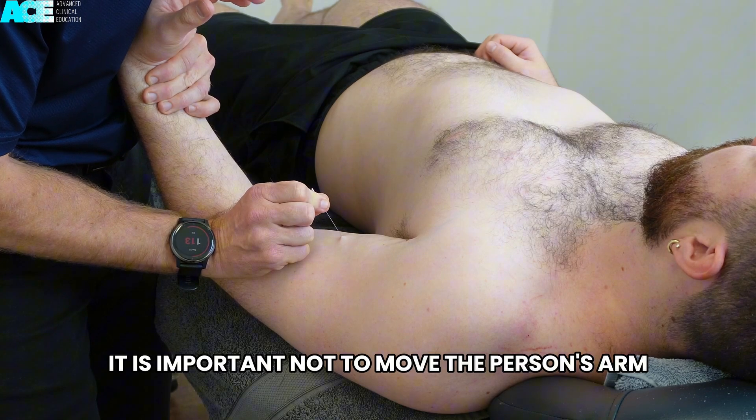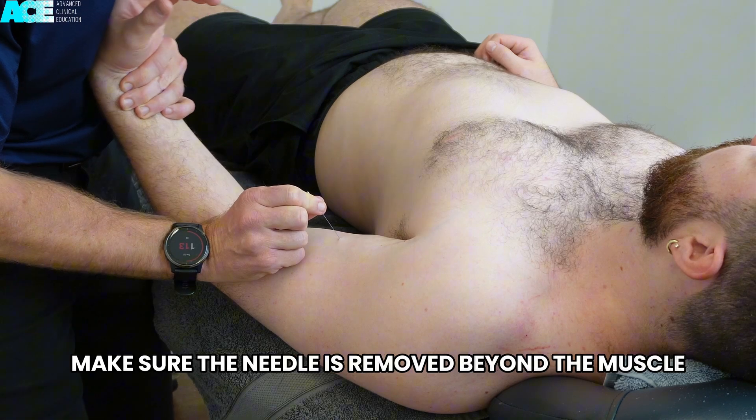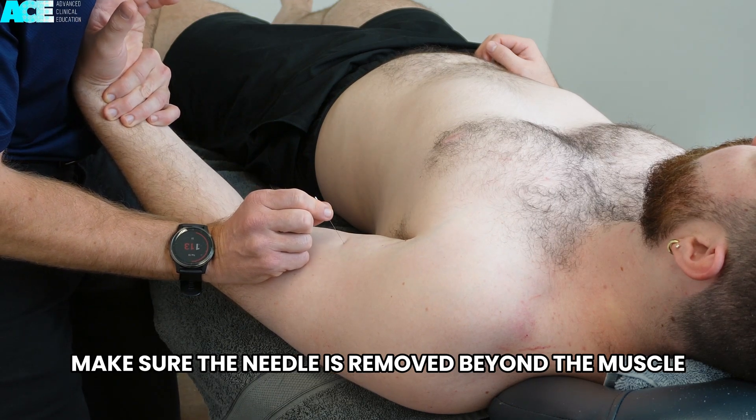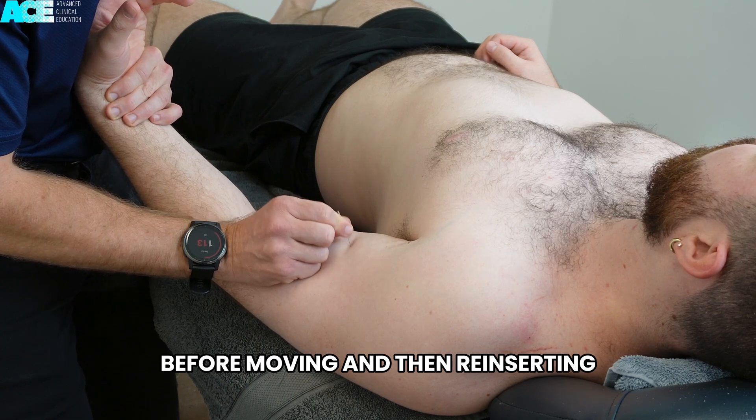It is important not to move the person's arm when the needle is within the muscle. Make sure the needle is removed beyond the muscle into the subcutaneous tissue before moving and then reinserting.